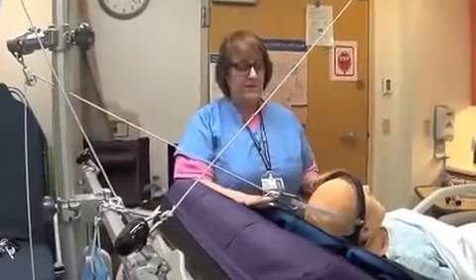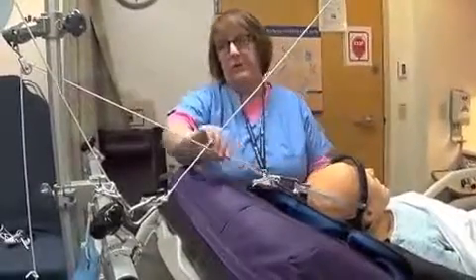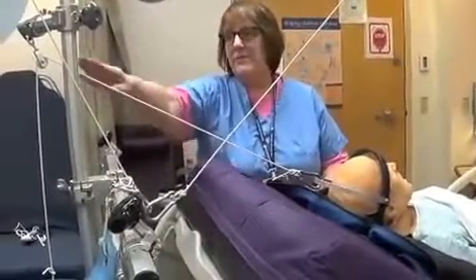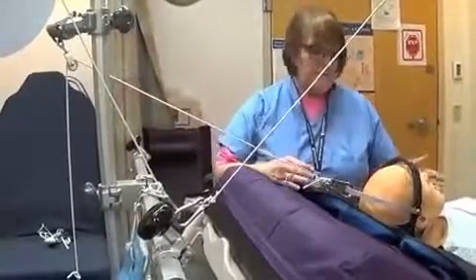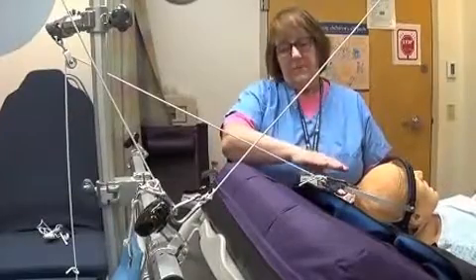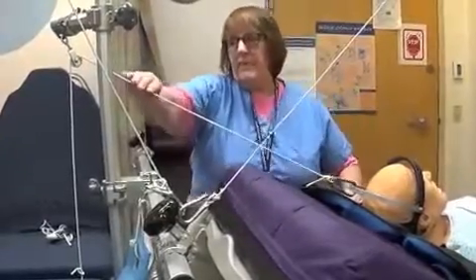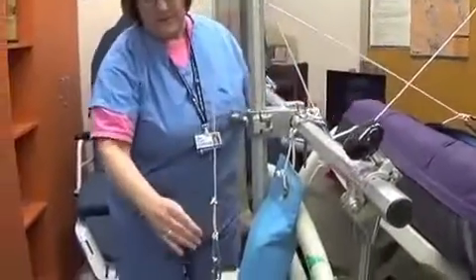This is the view from the side of the bed. If you're on the side of the patient, we're seeing the same thing as before — that this cord runs free, it doesn't bind in the mattress, it stays on the pulley, it's nice and straight. The patient's head is the way the doctor wants it. You follow it this way, and once you come to the back, this is the next area you need to check for safety.